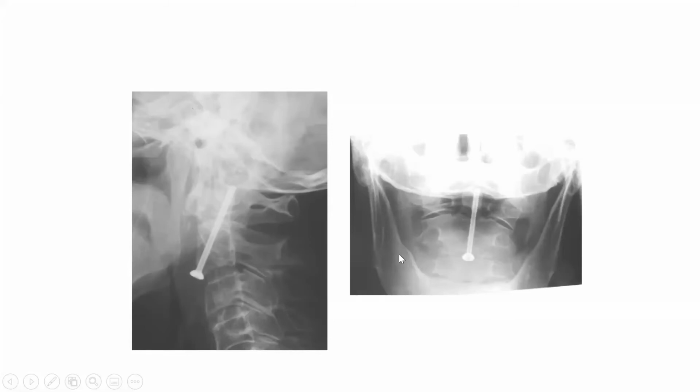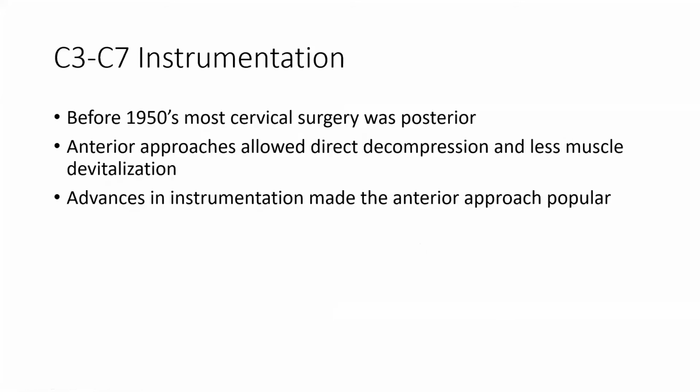This patient's nice because there are no teeth, but I promise you, there are teeth. They're always lying over the peg, and you cannot see the peg very easily. So it's a difficult approach, technically quite challenging. But it is described to fix a peg, and I've done probably about 10 or 15, and it's not a very satisfactory operation. But you just need to know about it.